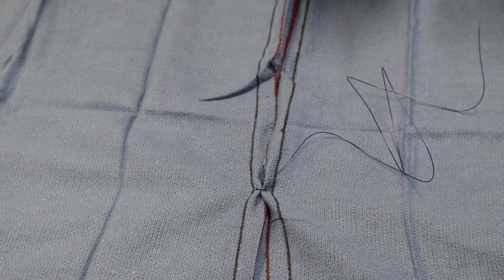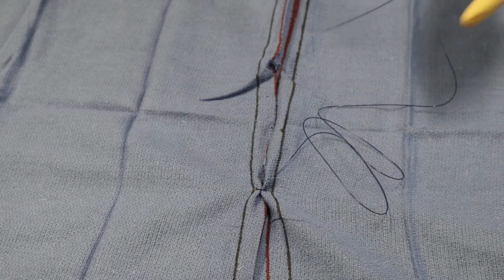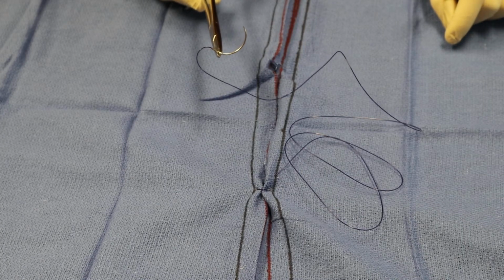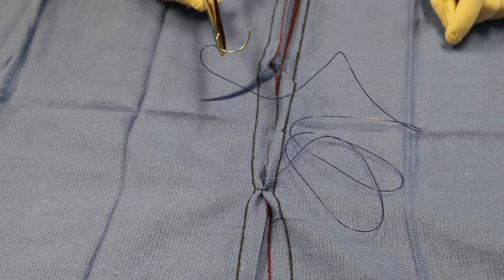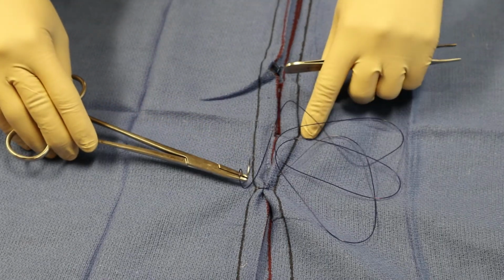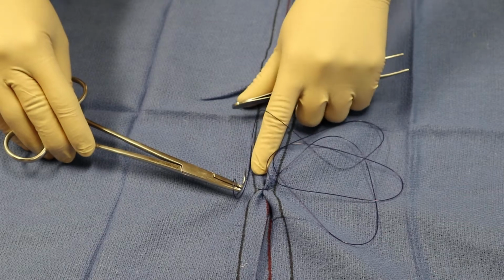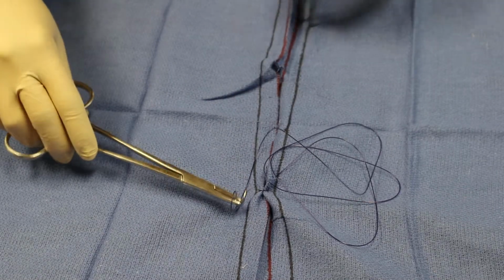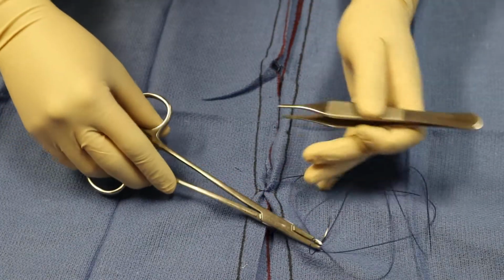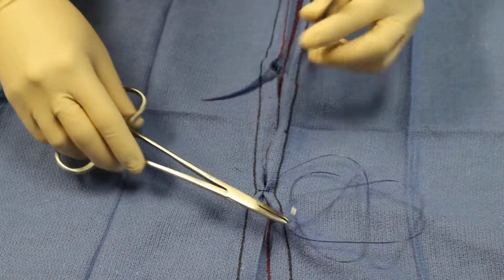So now that you're superficial, you'll go directly across the incision from where you came out and just start your Cushing pattern. So that is going to be like you're traveling down the black line and you're going to be parallel to the incision site. Okay, so on the black line. On the black line. So right across where my suture came out, right there?